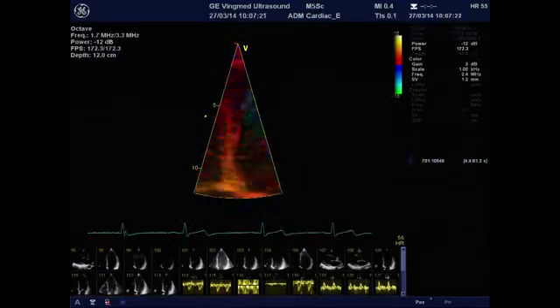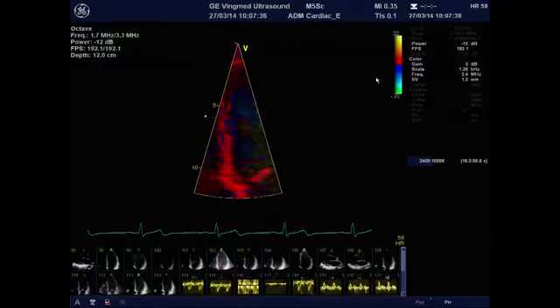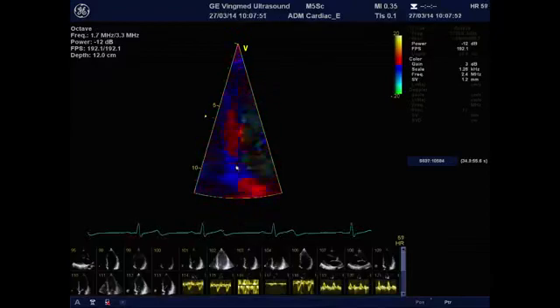There it's important to also look at your scale. If you see green reflections here, your scale is not adjusted well and you have aliasing in your image. So make sure your echo image is aligned well. You have a small sector angle because this will dramatically increase the frame rate per second. This allows you to store the image like that and then in post-processing to look at velocities in the different regions of your wall. Look at velocities, look at strain rate or strain, look at deformation. I'll show you another example as well.